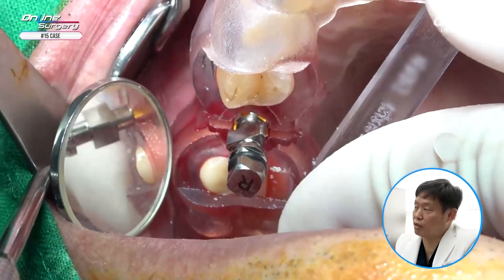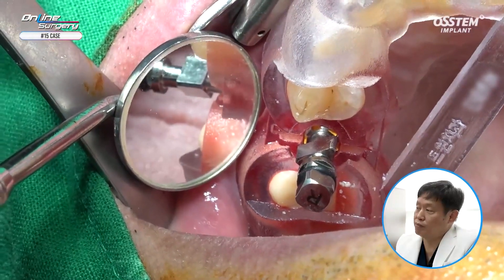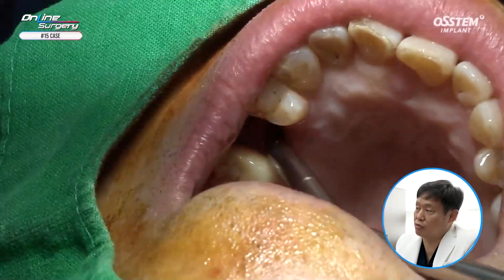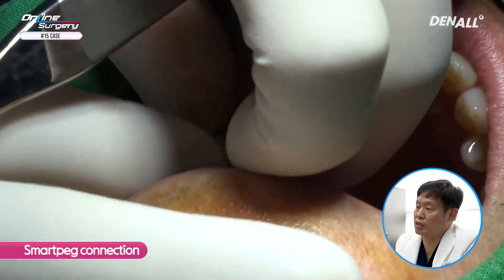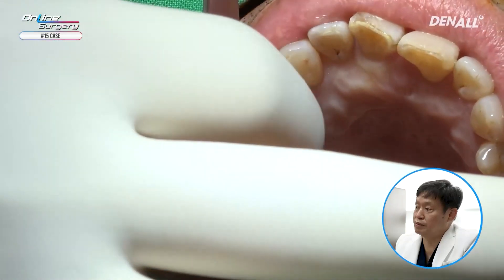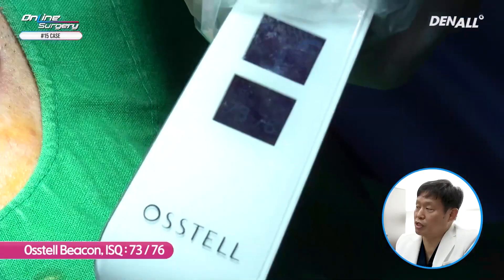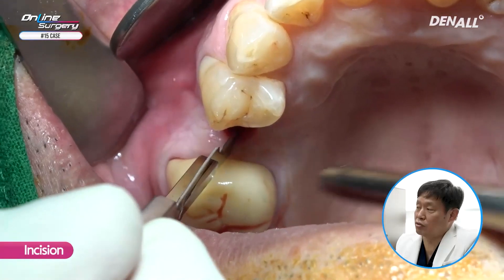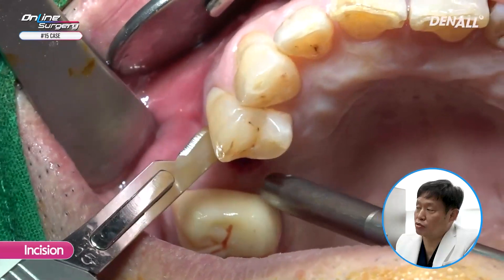Primary stability is over 30 Ncm. I'm checking the final position and the depth control is done. This is how the surgery was completed. Using SmartPeg, I checked the ISQ value — it was 73 and 76. Because after drilling it was quite favorable, in order to do additional bone graft, I made a minor incision on the buccal side.